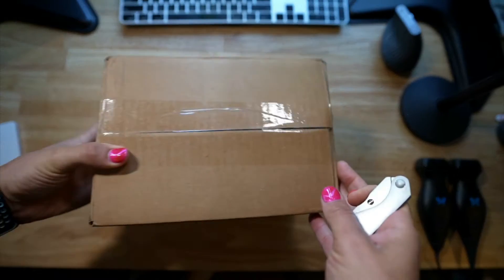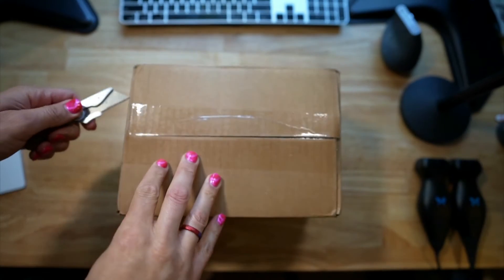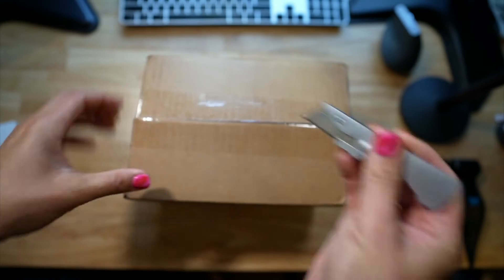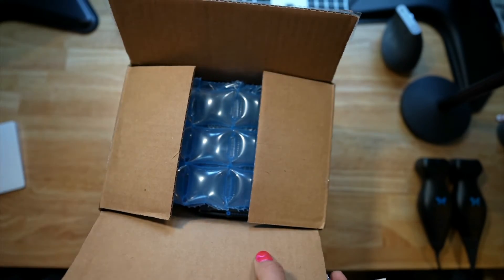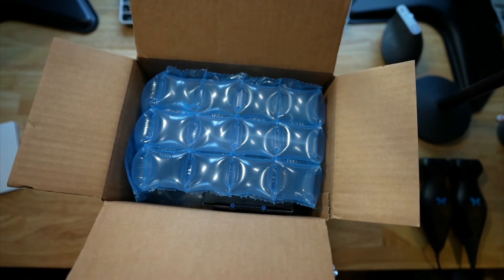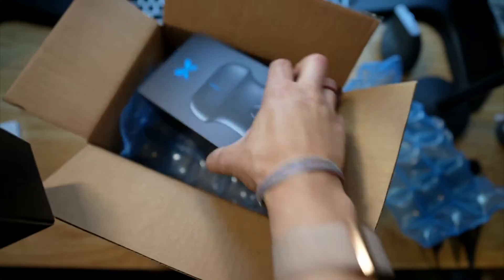Without any further ado, because I know we just want to see what it looks like, let me show you an unboxing. Here is the box — I'm going to cut this open here. And we got two things: a charger kit and the actual IQ itself.